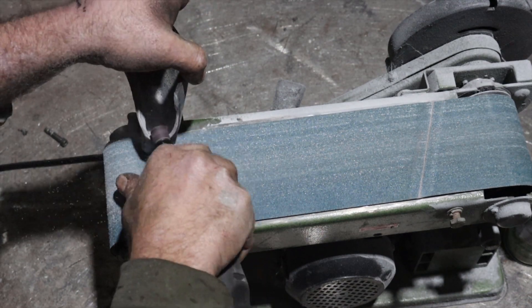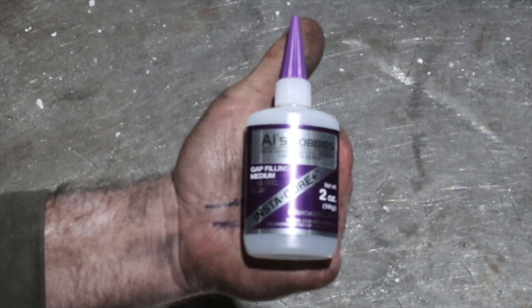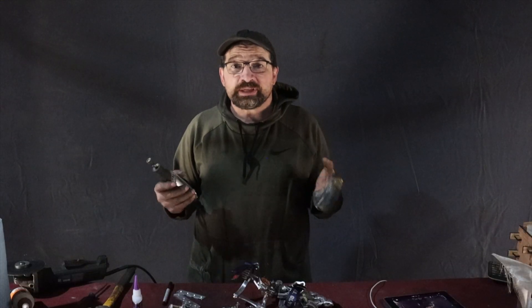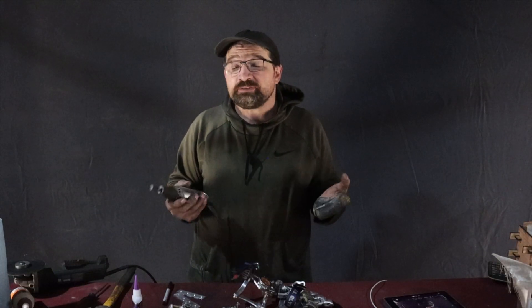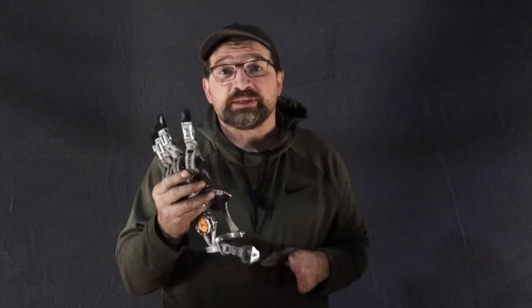Once you're happy with the fit, go ahead and ease all the edges inside and out and seal them with a thin layer of super glue. This will harden and encapsulate any stray fibers that pop up, leaving you with a finished edge. Before you go and paint the shell, you're going to want to completely assemble the device and make sure that the fit and feel is something you're going to be happy with.